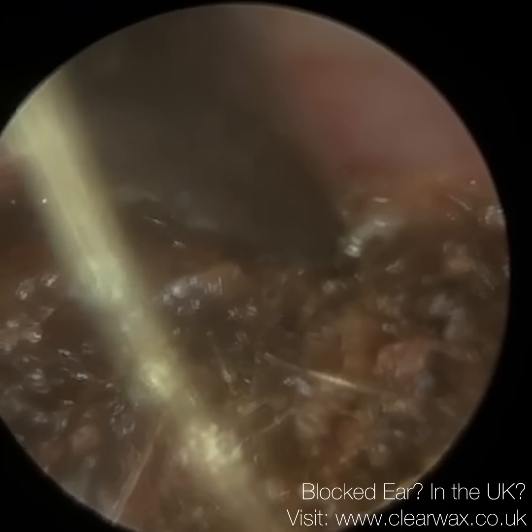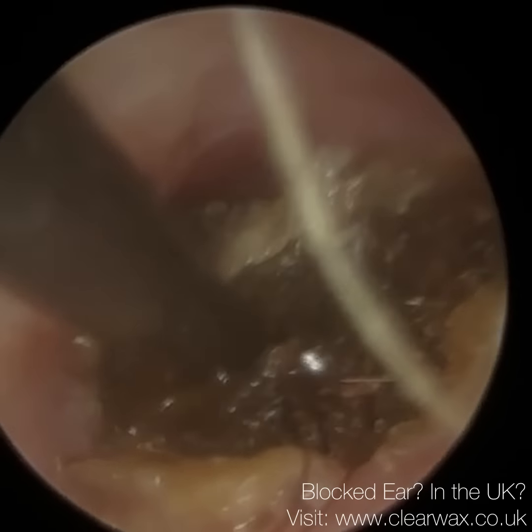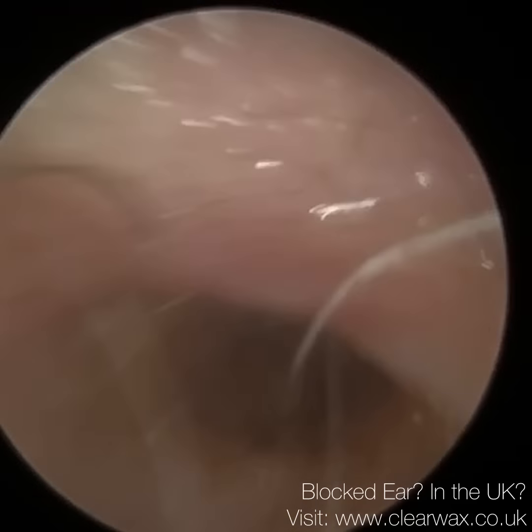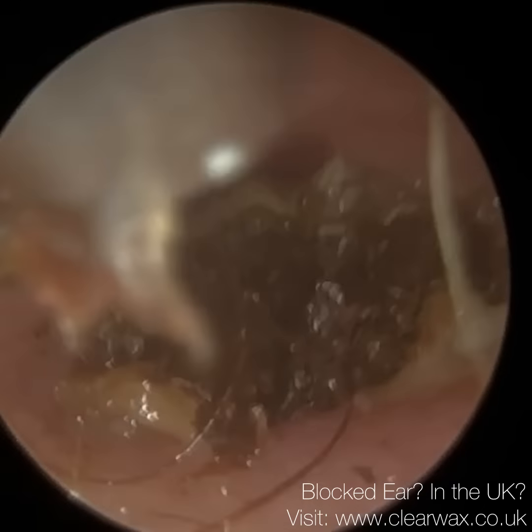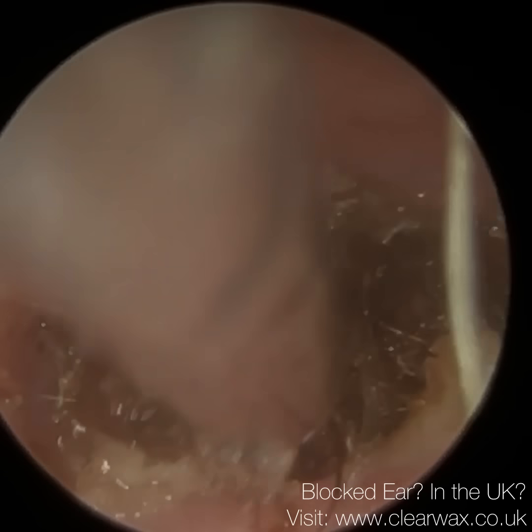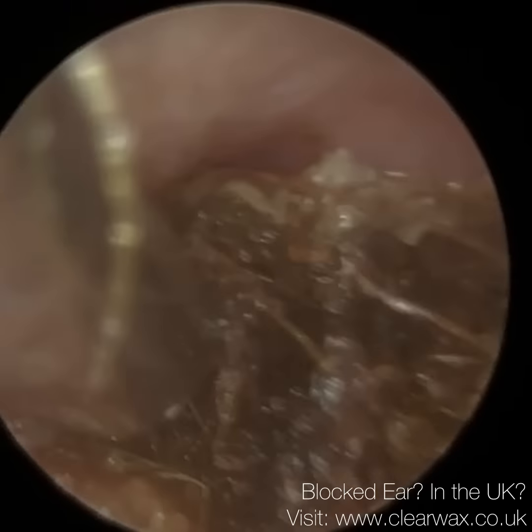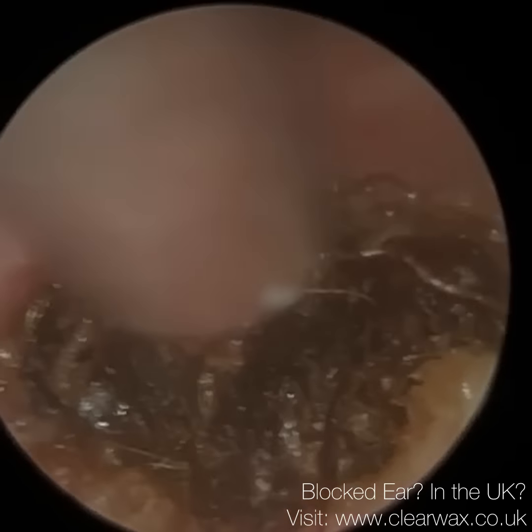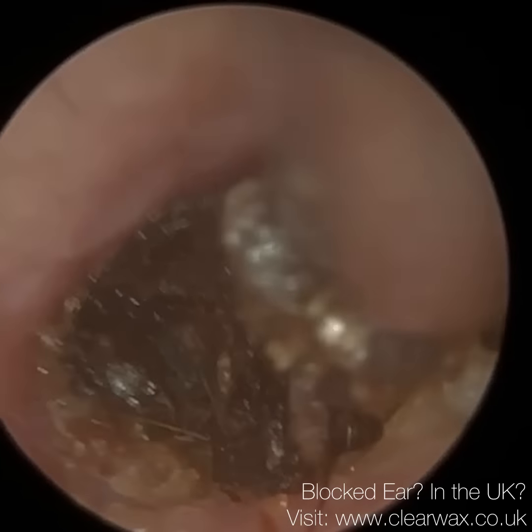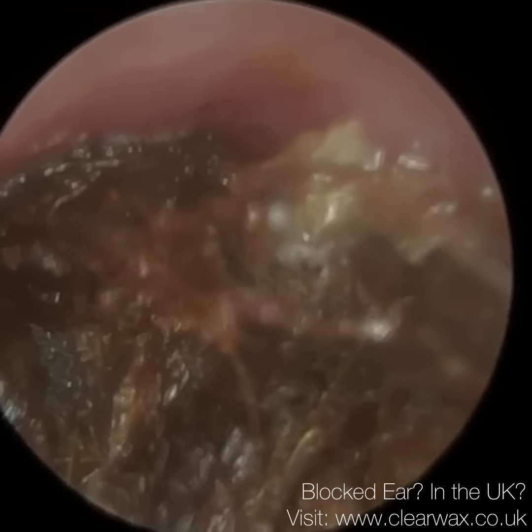I think I'm just using the ear hook again. I'm just going to turn this, as you can see, and trying to drag it forwards, but it's not, well, it's separated a little piece there, which I'm going to suction away, I think. There we are. But I have now almost chiseled this, broken it down, I've dissected it, so you're going to see little pieces coming away. For example, this piece there. I think in a moment I'm going to get a larger piece out.